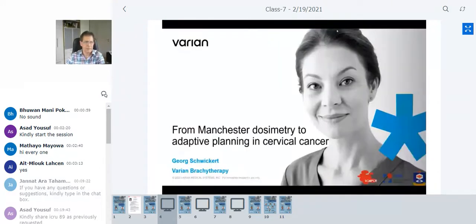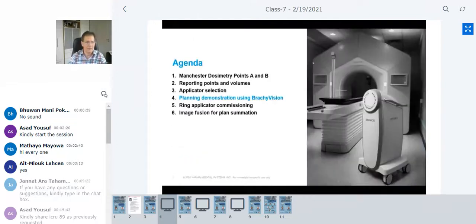So good evening, everybody. I hope you are still well and healthy in these difficult times. Today I want to talk about the Manchester dosimetry system and how we create plans, standard plans, which means intracavitary plans, and how we can move to the more image-based planning or adaptive planning for cervical cancer. And here are my topics.